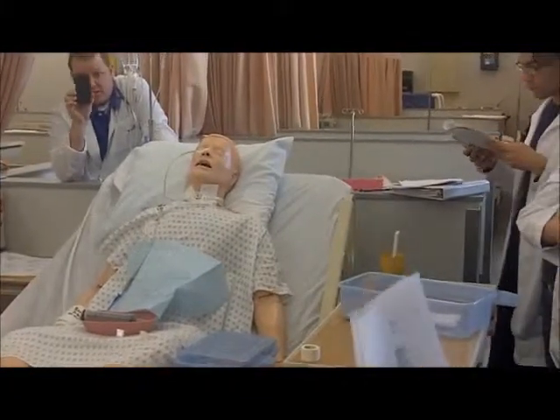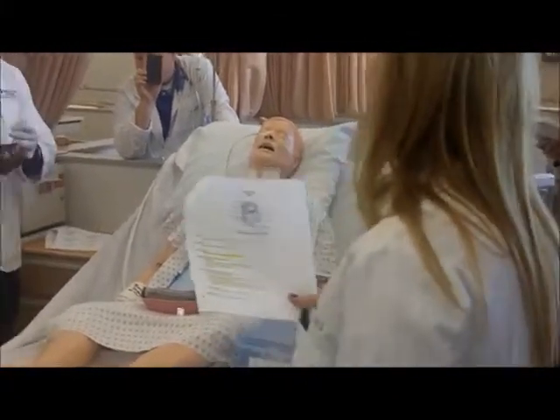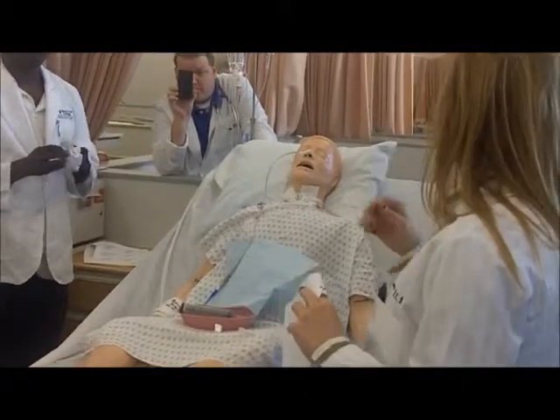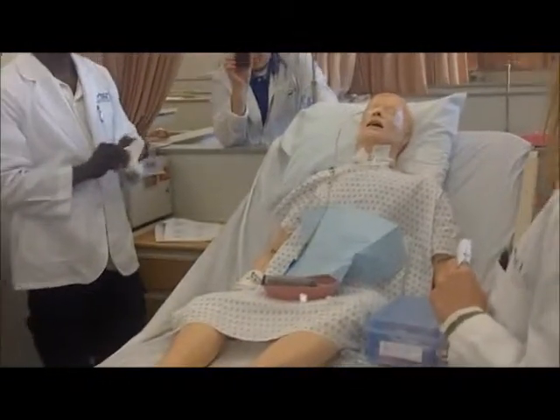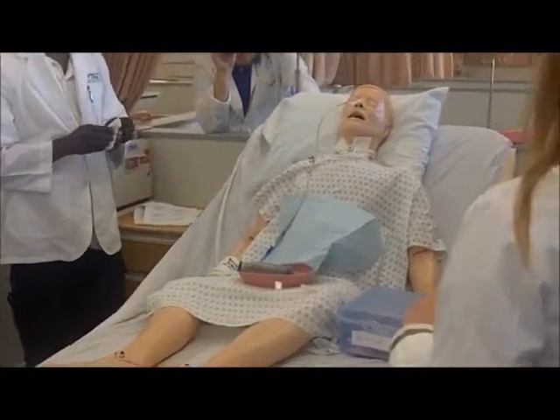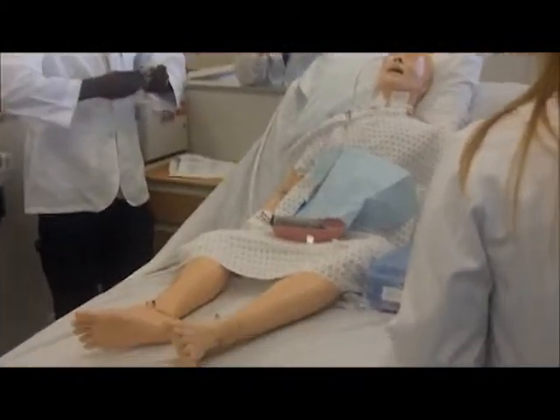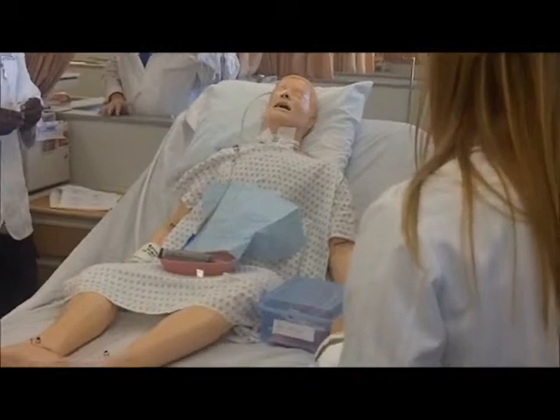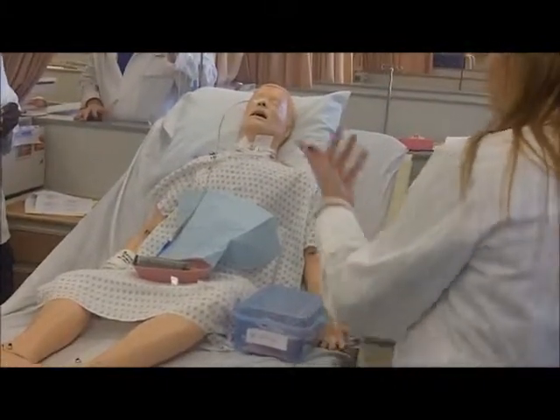We're not supposed to hook it up? Suction is probably part of it, then. We're going to get that in a second, and set it at whatever level. So you can either do the air bolus to check for placement. Most hospitals want a chest x-ray. So whatever hospital you're working for, you want to find out what the hospital protocol is. Most of the time, they want a chest x-ray. So now you want to attach it to suction.